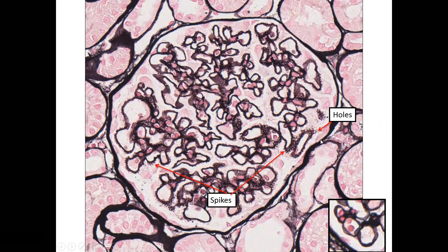Yes, we have a question from OSU. Is Jones also the best thing to see mesangial interpositioning? Yes, so the question was, can we see mesangial interpositioning with Jones? And that will be the next PowerPoint slide. You have predicted me well.